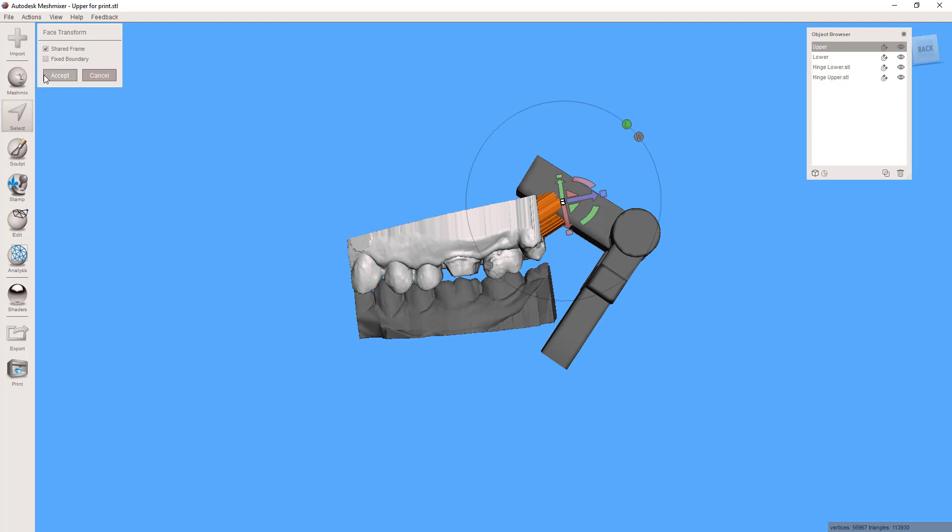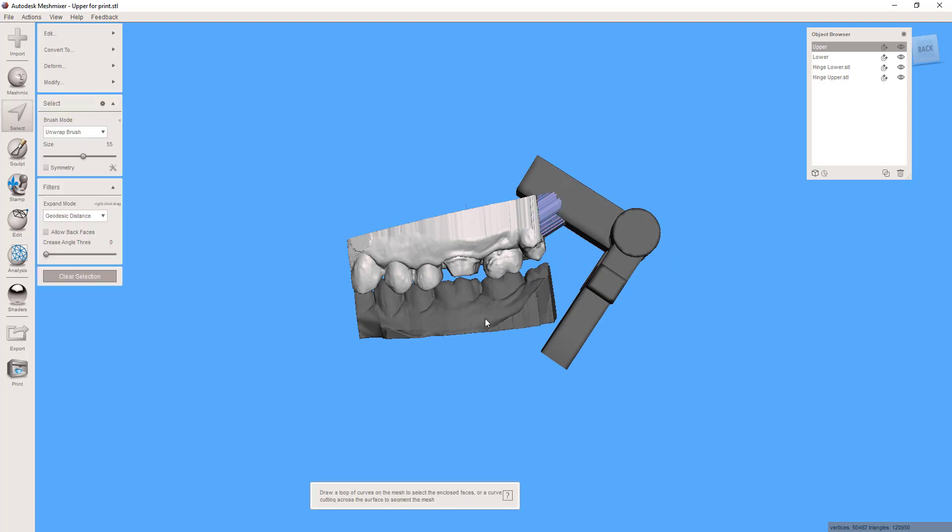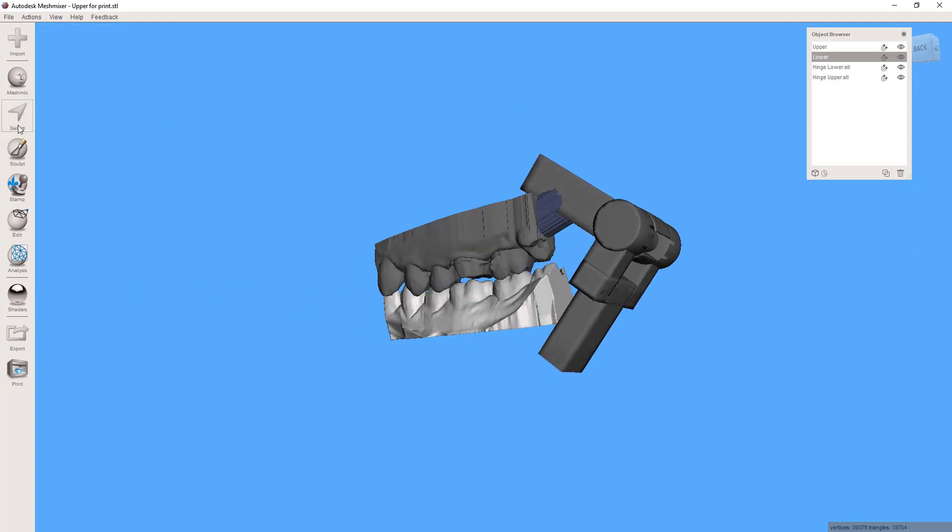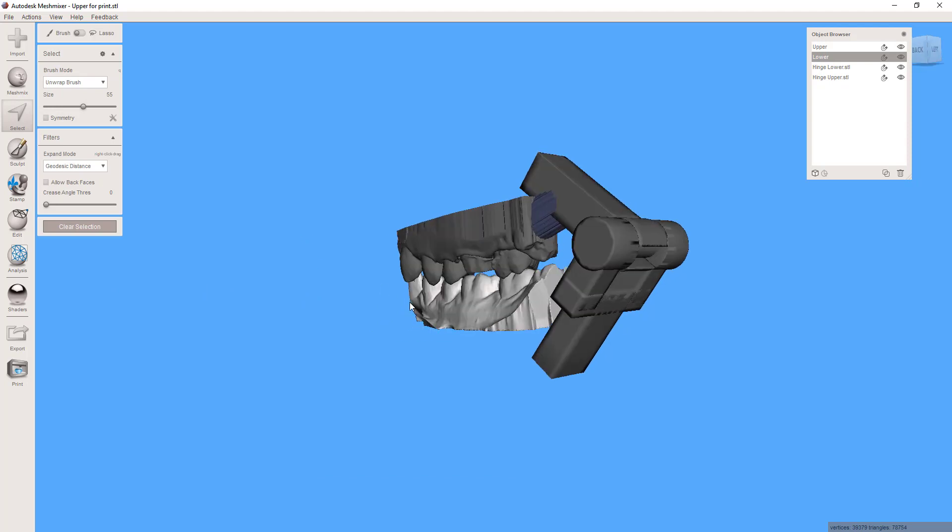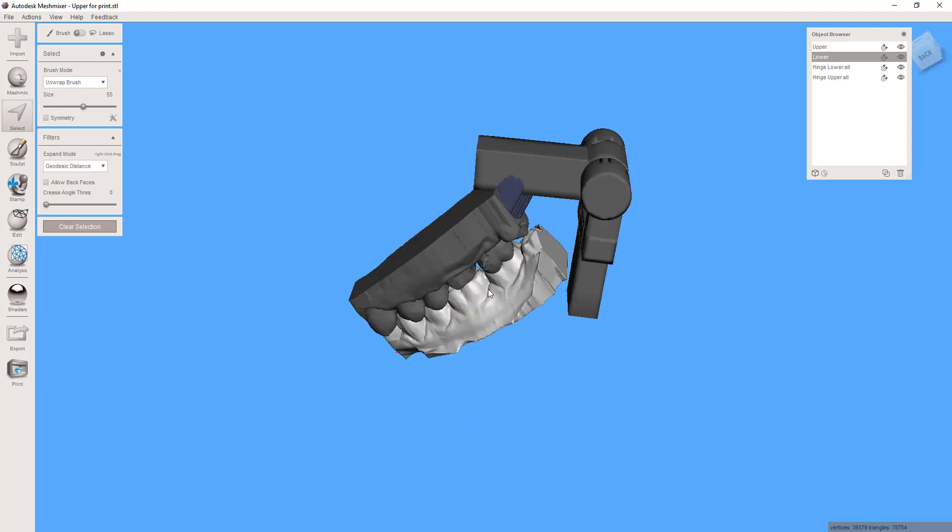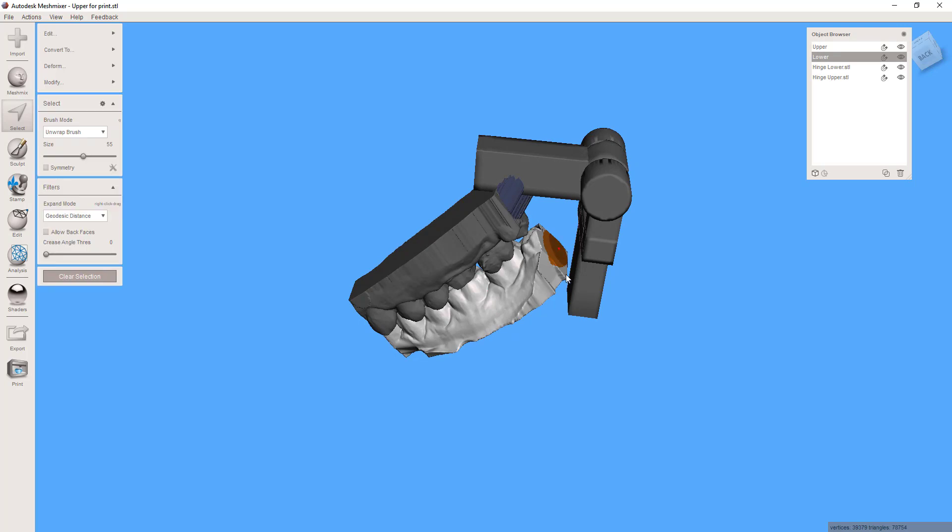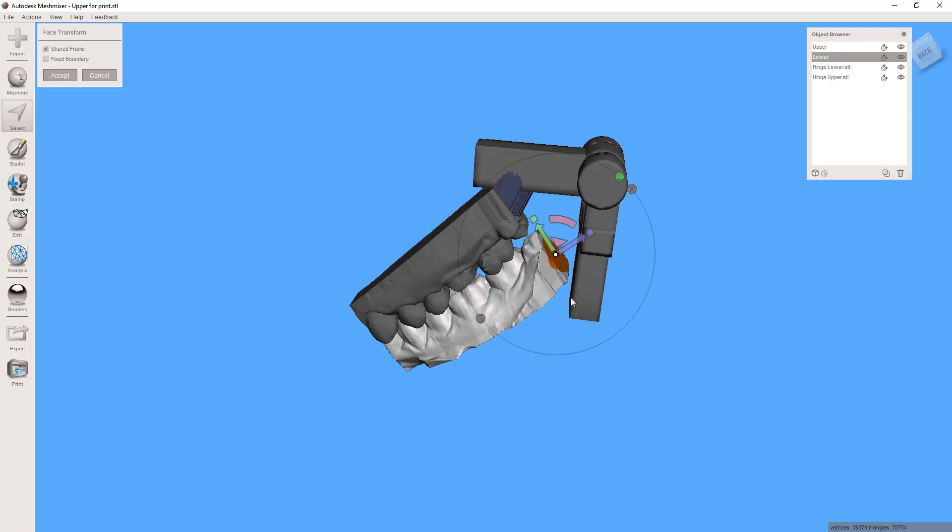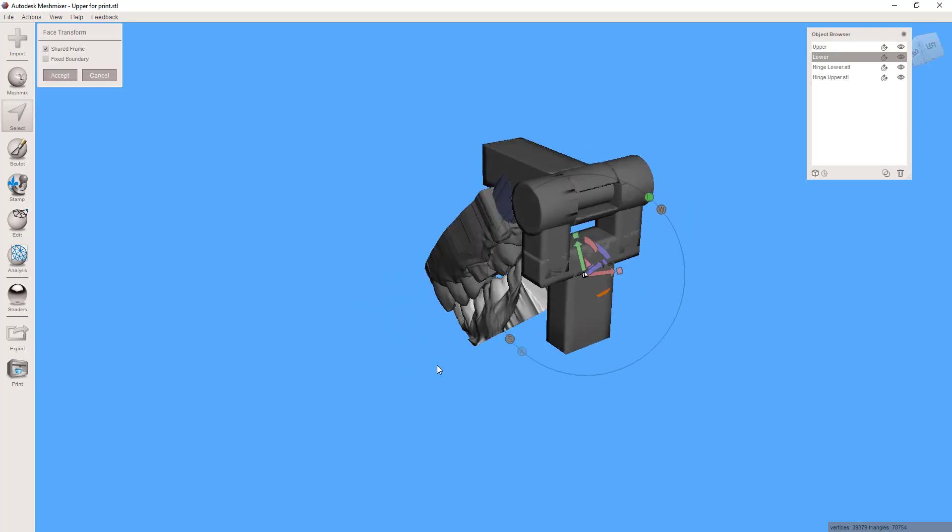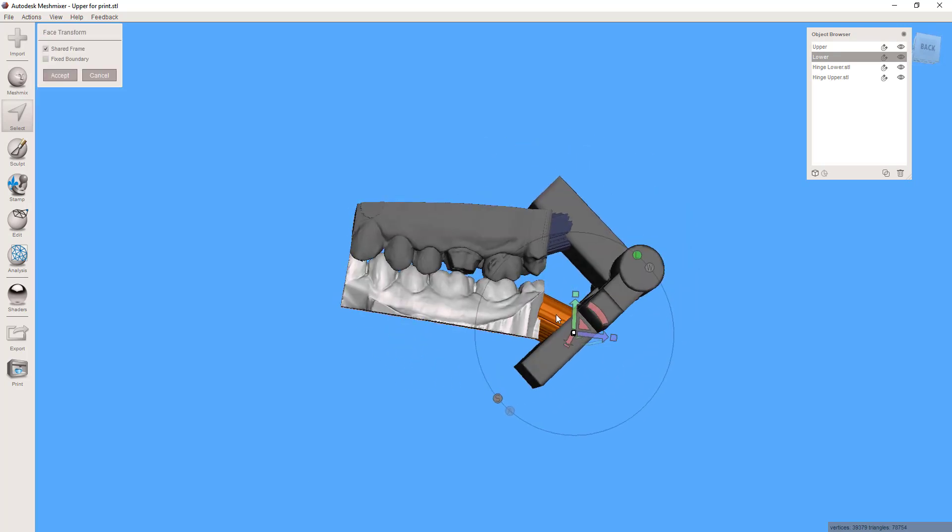Okay accept that. Repeat the process on the bottom, select, T for transform, pull it straight back until it's connected.